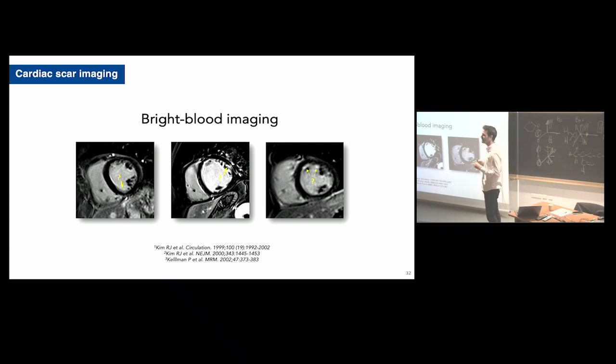These are 3 other cases we had in Bordeaux where our 2 radiologists did not agree on what they were seeing. Here we see bright pixels touching the subendocardial layer, you remember. Is this myocardial infarction, or is this artifacts, breathing artifacts, blood, whatever? One of the radiologists was saying, oh yeah, this is scar. The other was saying, no, this is blood that is trapped between the papillary muscle and the healthy myocardium. So they did not agree.